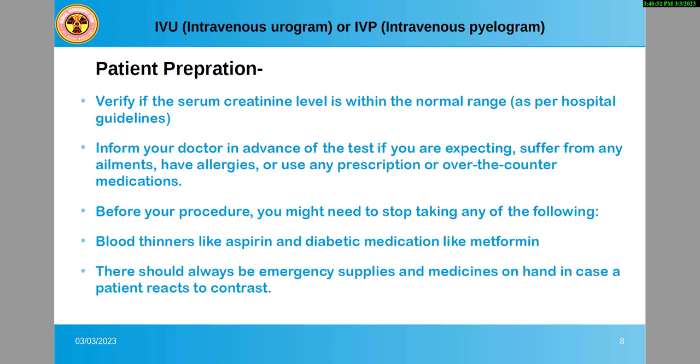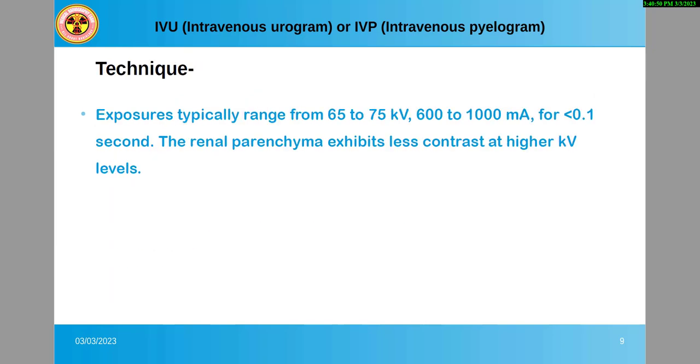Before your procedure, you might need to stop taking blood thinners like aspirin and diabetic medication like metformin. There should always be emergency supplies and medicines on hand in case a patient reacts to contrast.